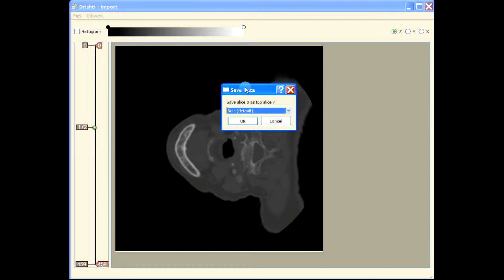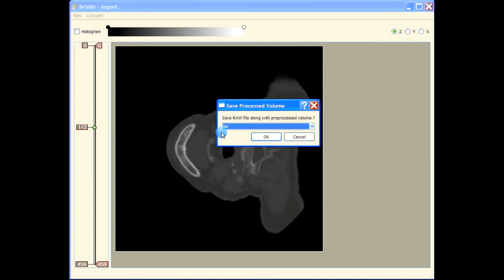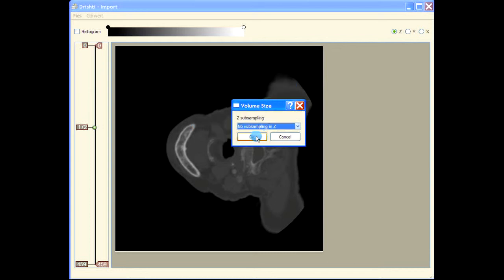Depending upon how you see the image stack, your left and right hand sides are going to change because you can look at the image stack either from the top or from the bottom, and this will affect what is the right hand side and what is left hand side in your render dataset. For the time being, let's just save the top slice as the zero slice. We don't want to save the raw, we don't want any subsampling.